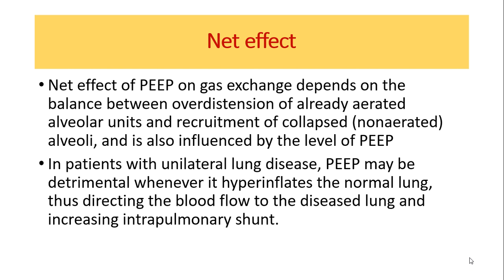Get it? Unilateral pneumonia, you don't go about PEEP of 15, 20, it won't help you. Eventually what it's going to cause is further diversion of blood into the infected area and cause more shunt. So that really won't help you.